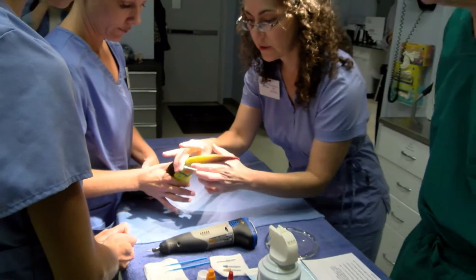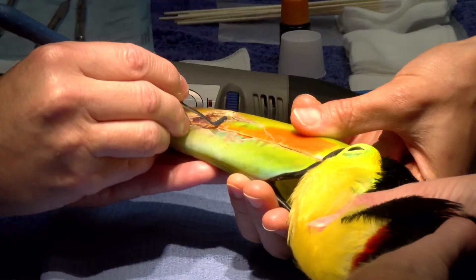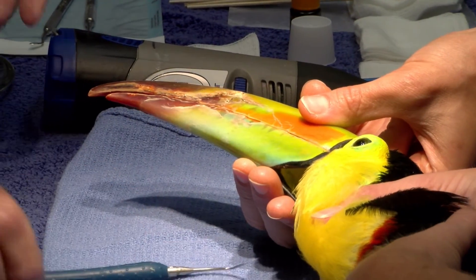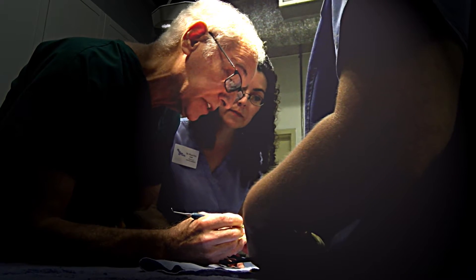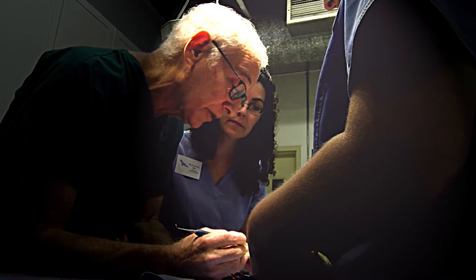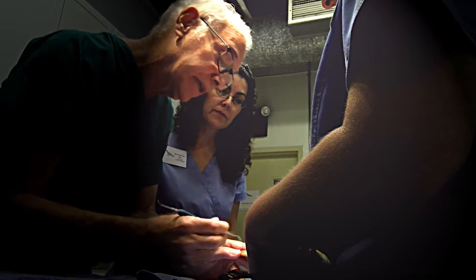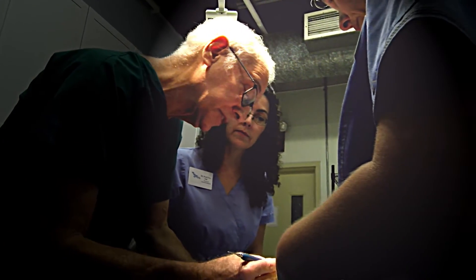Dr. Pacersky, if you want to take a look at Bob here — what would be your advice as a dentist? I would try to just bond into it and try to seal the layers. And then with observation after the procedure, see how it holds up. Because I don't know if I would want to get involved in too much mechanical manipulation in such a delicate area.